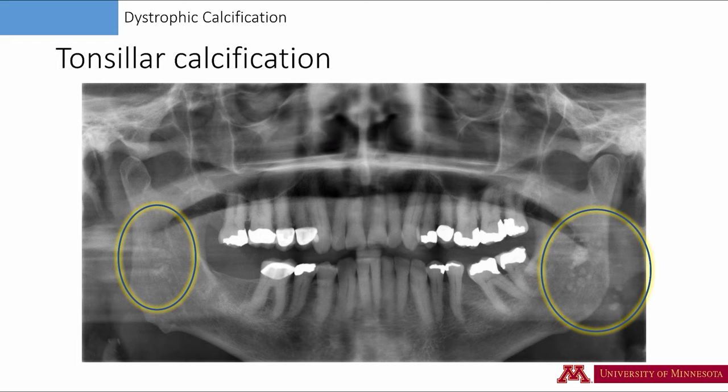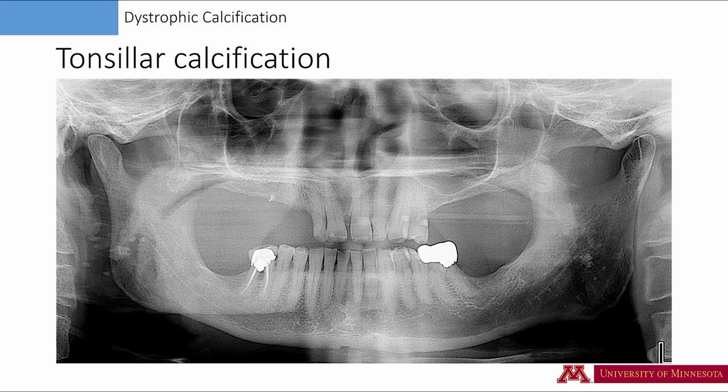As you can see, some of the calcifications are larger than the others. On this radiograph, again we see bilateral tonsillar calcifications. This time the calcifications are larger on the right side. The patient is partially edentulous, about 65 years old. I am not putting a circle over the radiopacities, expecting that you have already identified these tonsillar calcifications.